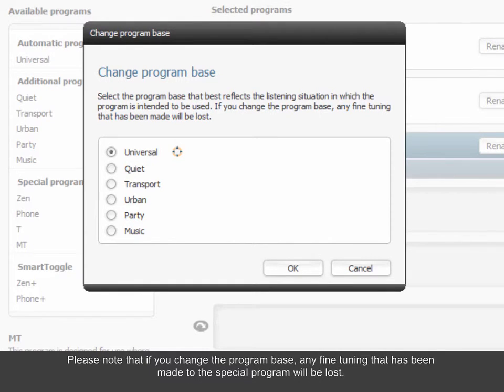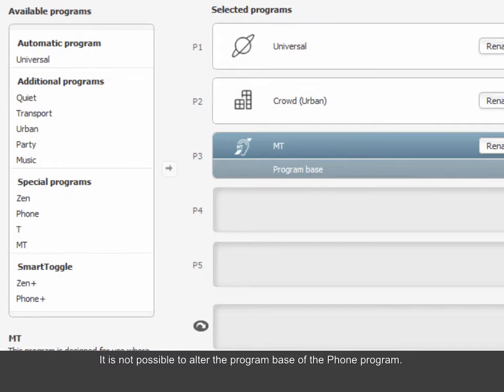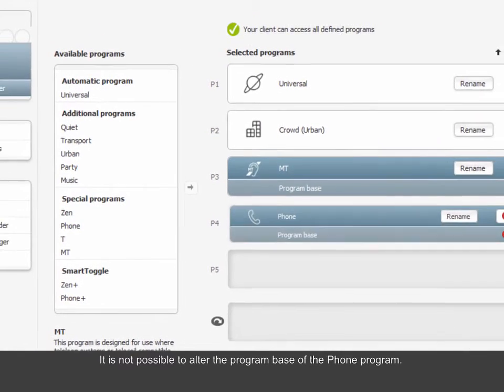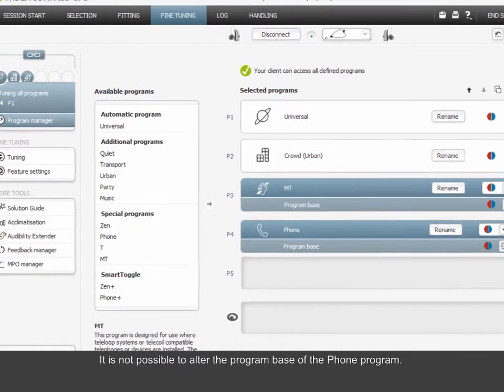Please note that if you change the program base, any fine tuning that has been made to the special program will be lost. It is not possible to alter the program base of the phone program.